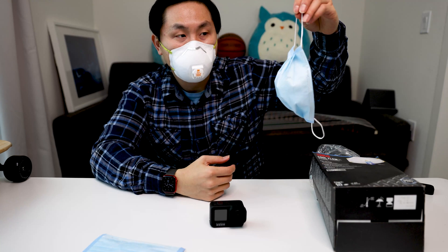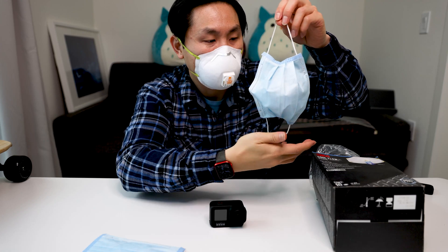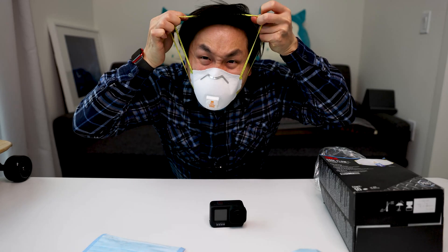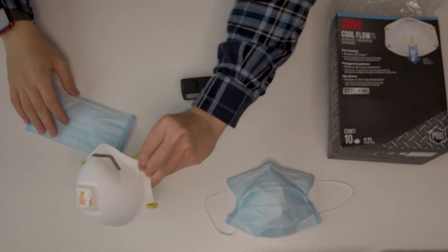When you are done with the mask, if you are not sure if it is contaminated or not, you should probably throw it away and wear a new one next time. However, if you are sure that there is nothing wrong with it, when you take it down you should hang it somewhere. Prevent any type of contact with the outside of the mask. And take off this one and place it on another place.